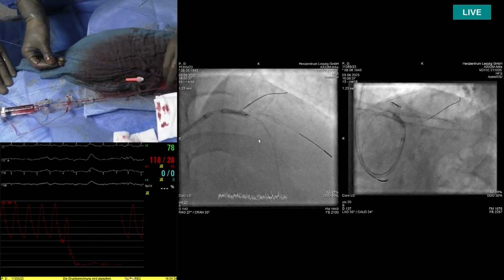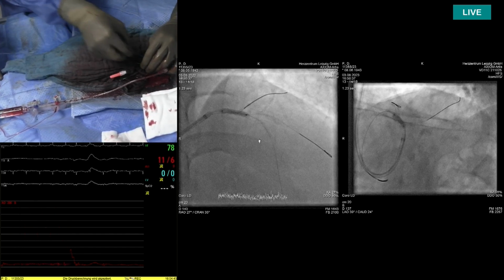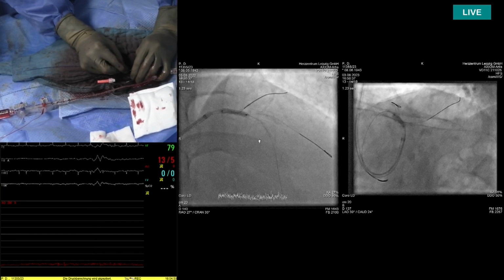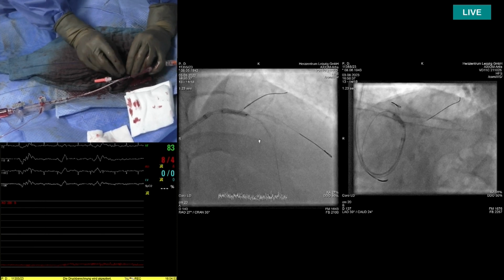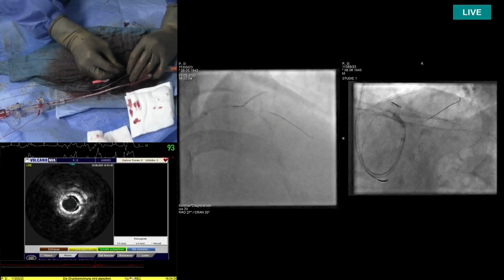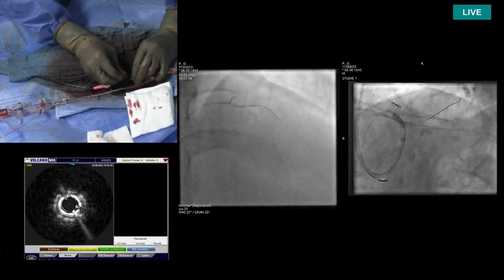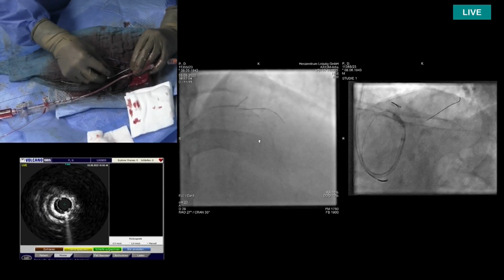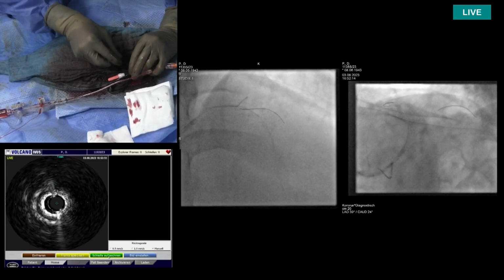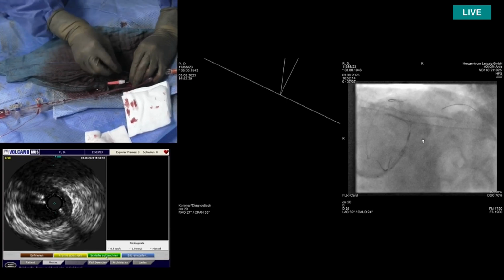It's not, so I would probably use something else, either a cutting balloon or maybe shockwave, but I would incline to use the cutting balloon first in this case, because in the left main, I don't want to use a lot of inflation time in order to apply the shock waves. So in this case, probably you would shift to a cutting balloon. You have also, of course, the super high pressure balloons, but I don't think we will need them here. Can you cross? I don't know.